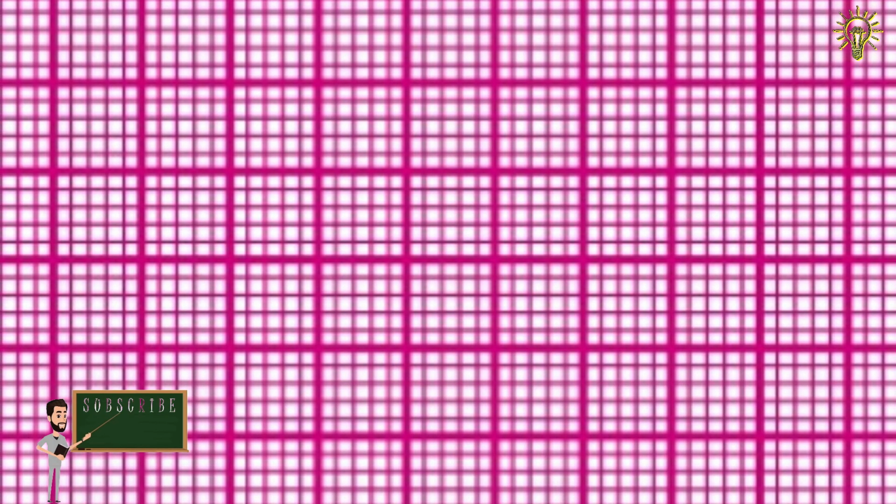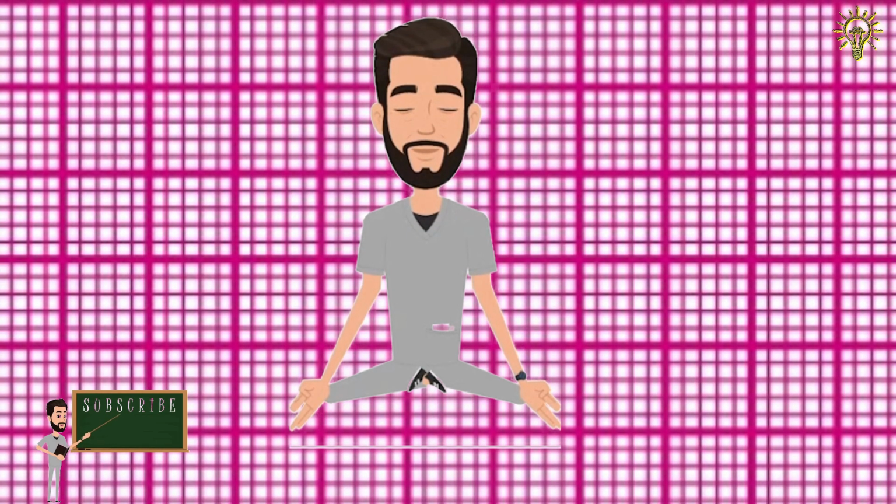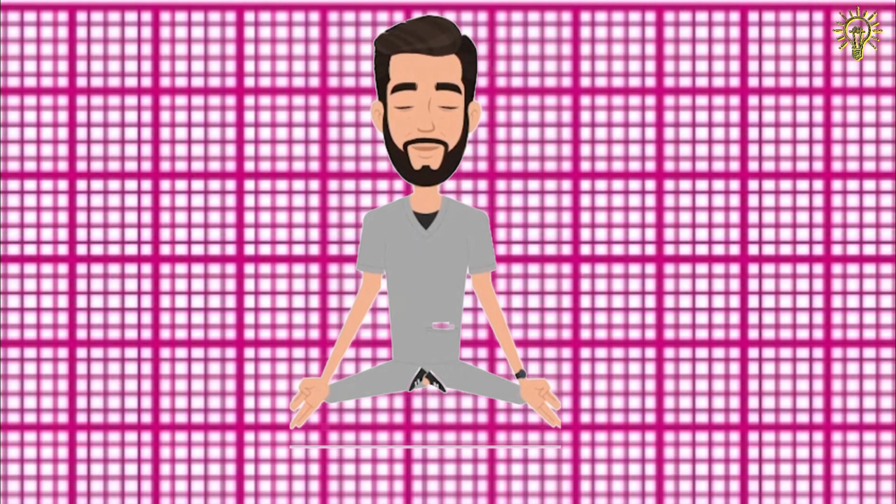This is all for today. Now that we have covered the ECG waveform and axis system on 12-lead ECG, in the next episode, we will talk about how to systematically interpret ECG and reach diagnosis.